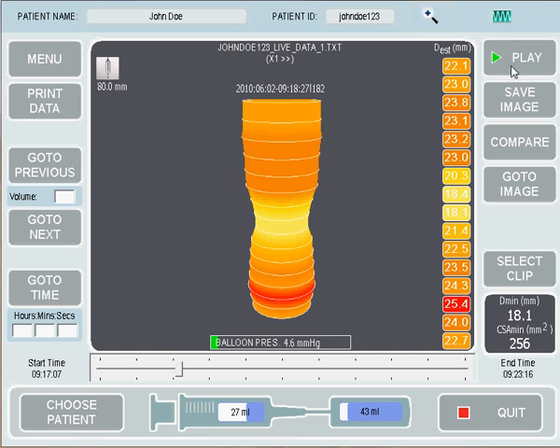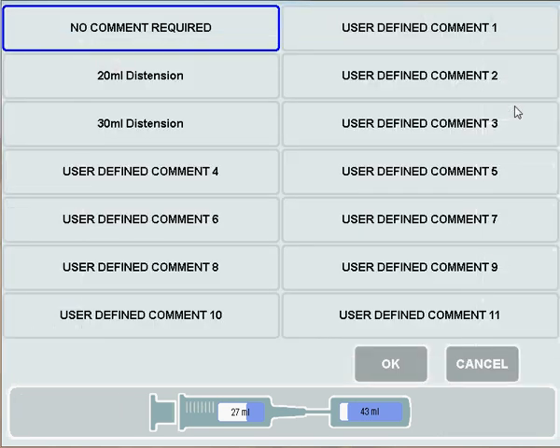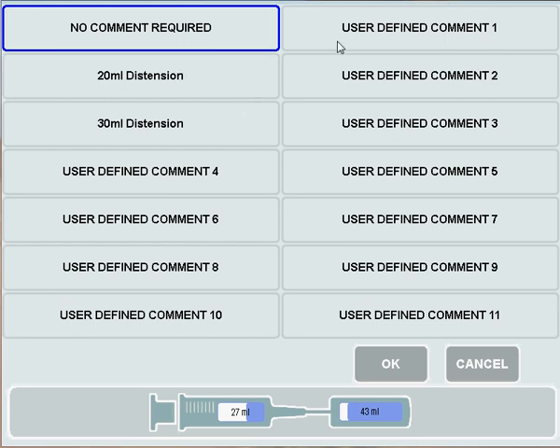If we'd like to save an image — perhaps the image on screen is of interest to us — we can press Save Image and decide to either save it without a comment, save it with one of the predefined comments, or edit our own comment. To edit our own comment, we press on any of the comments, press Edit Comment, and put in our comment. So let's say our comment will be 'flip', then press OK.